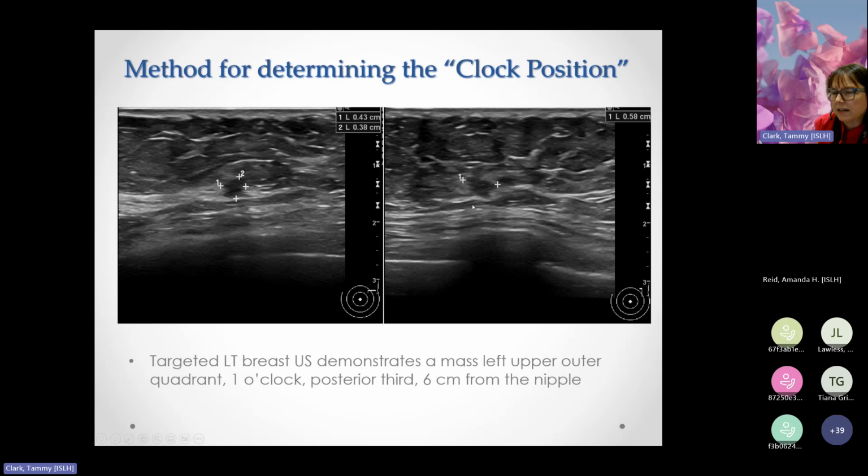It's a very small cancer. It's about 5 millimeters. It's 6 centimeters from the nipple, and this was a biopsy proven lesion, and it turned out to be DCIS grade 1. So this lesion would have been excised, and then the full pathology would have let us know if there was any invasive component, and then they would have moved forward from there to see what treatments she needed at the cancer clinic. But this is where mammography and ultrasound, when you use them in conjunction, we're finding these very small, non-palpable screen detected cancers. And that's a great day of work. That's exactly what we want to do.